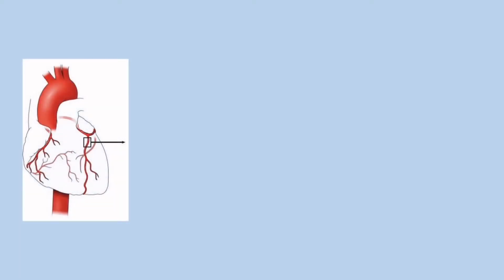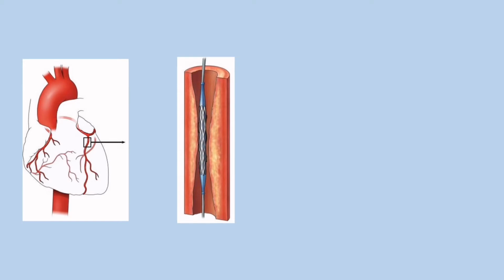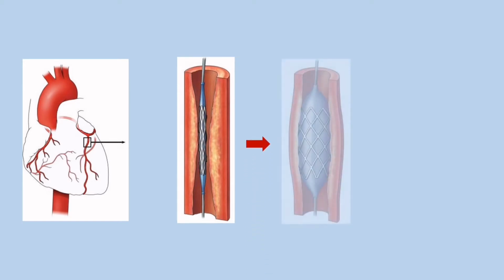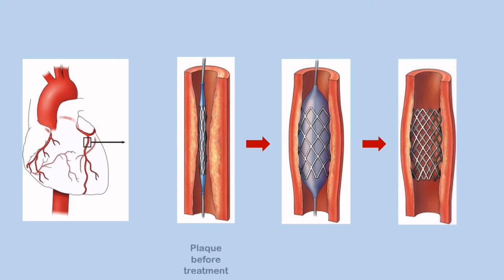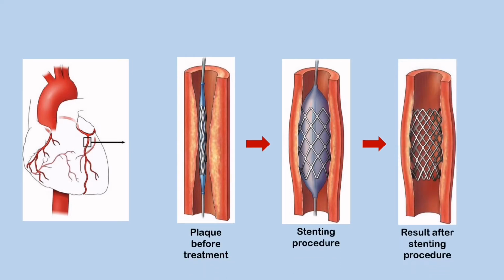What presents interest for us, however, are the coronary stents. These small expandable metallic devices are introduced into the coronary arteries and act like a scaffold to help widen a clogged artery and restore the adequate blood flow to the heart.